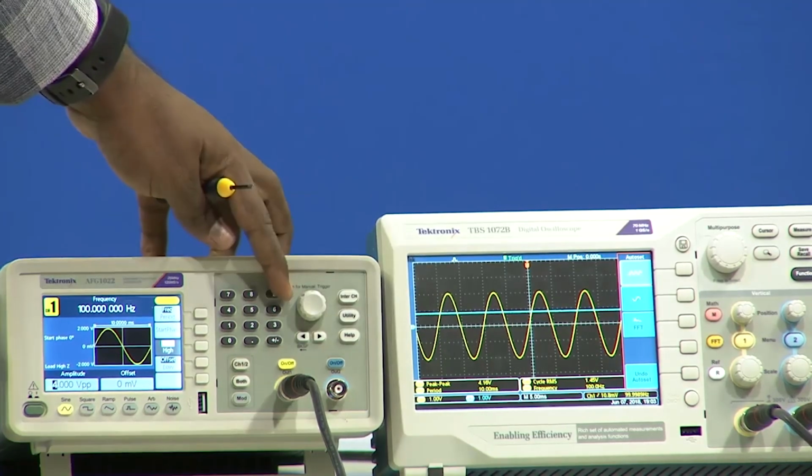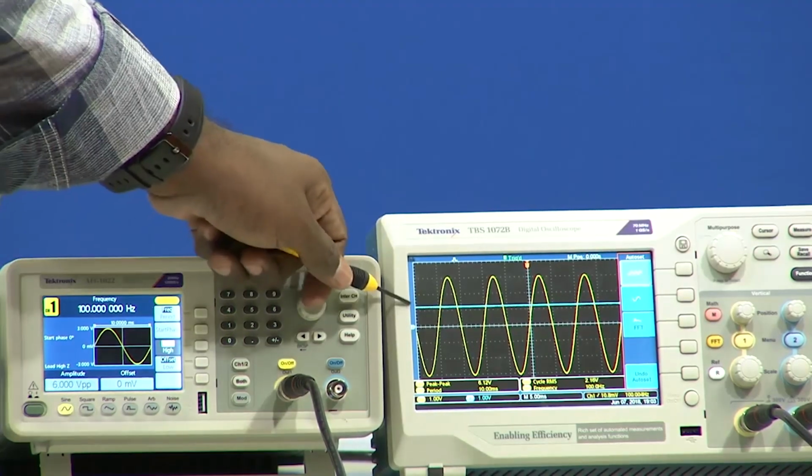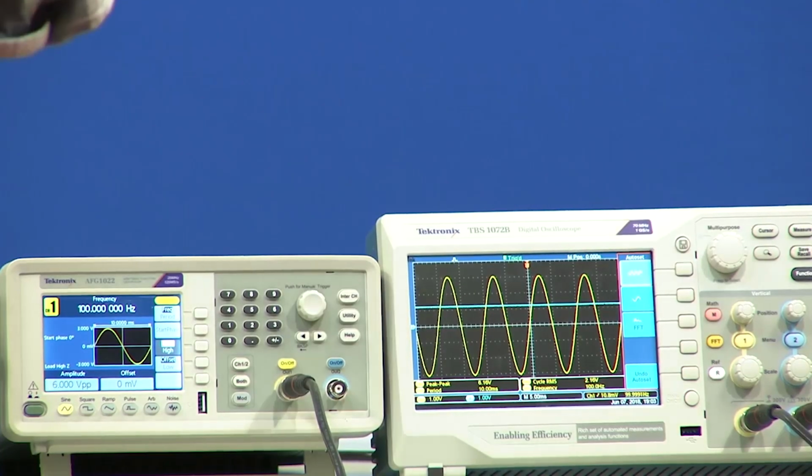Let me change to some other value, 6, so it is 1.2, right. So either because of the previous loading or because of the tolerances of the resistance value, the expected threshold value and the actual are a little different, but by putting in a potentiometer, we can even set it to the required threshold value in this case.